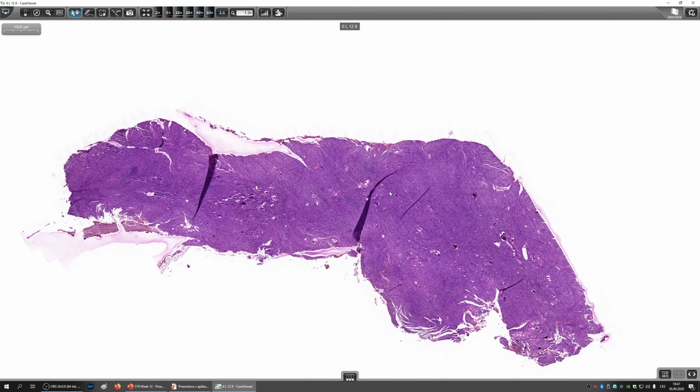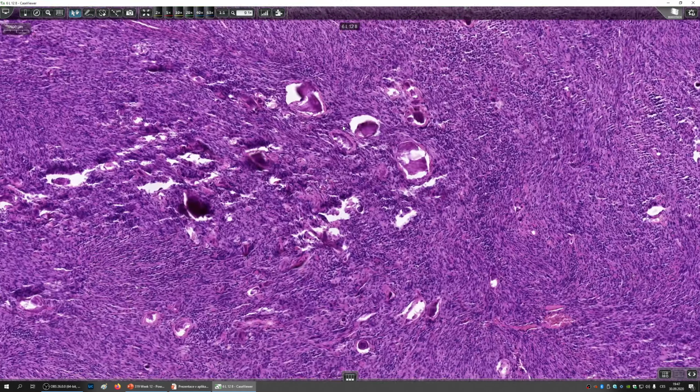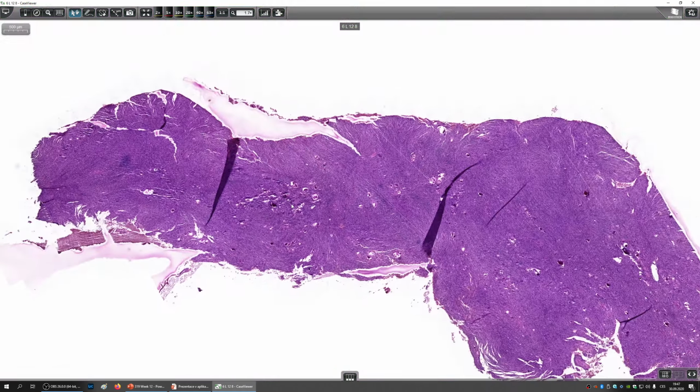The majority of cases probably never become symptomatic for the patient, so not every case is treated. We often see it during autopsy as a small surprise. So recognize the psammoma bodies, there are multiple, this should make it quite easy. So let's move on to CNS neoplasms.